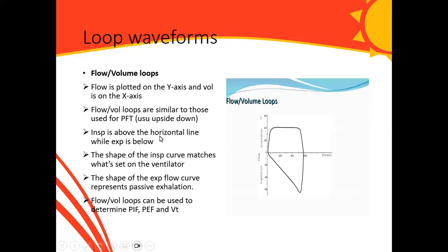All right, inspiration is above the horizontal. You can see that, while the expiration is below. For pulmonary function test or lung function test, it is the other side. The expiration is above, while the inspiration is under.